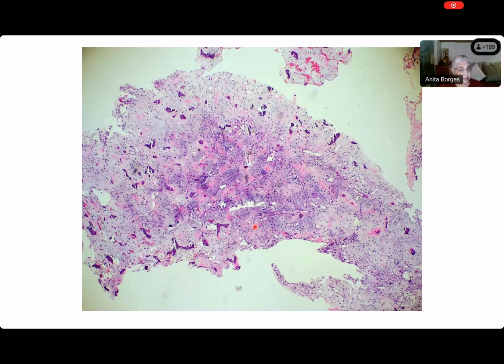Very good. So who was doing this now? I think it was Sarangi, right? Sarangi, were you describing this? Yes, ma'am. All right. So now, you see something, and it is myxochondroid. You can't make out classical hyaline cartilage, and yet you can see that it is blue, and it is a myxochondroid matrix. So it is a tumor. You can make out that it is a tumor, yes or no? Yes, ma'am. Yes, it's very cellular. It is a tumor, and it has a myxochondroid matrix. So straight away, you thought you were dealing with a giant cell tumor, and it is not a giant cell tumor. Excellent. And you also see areas of calcification, right?